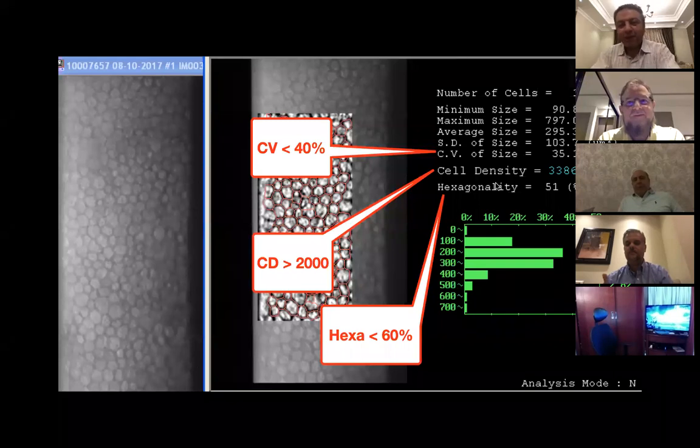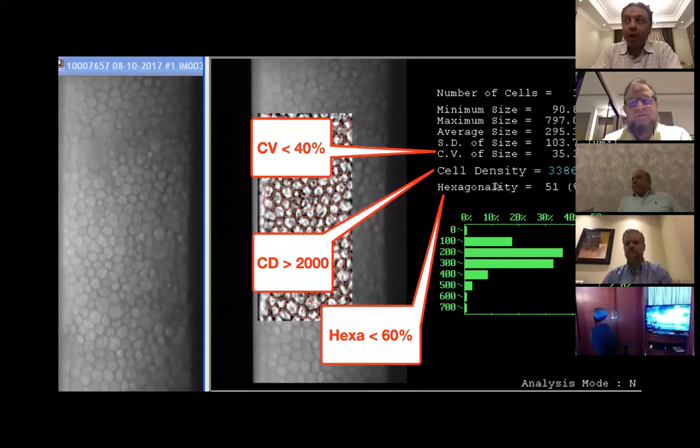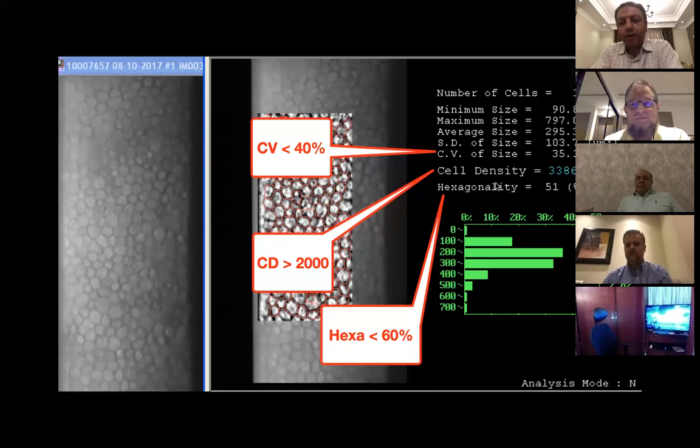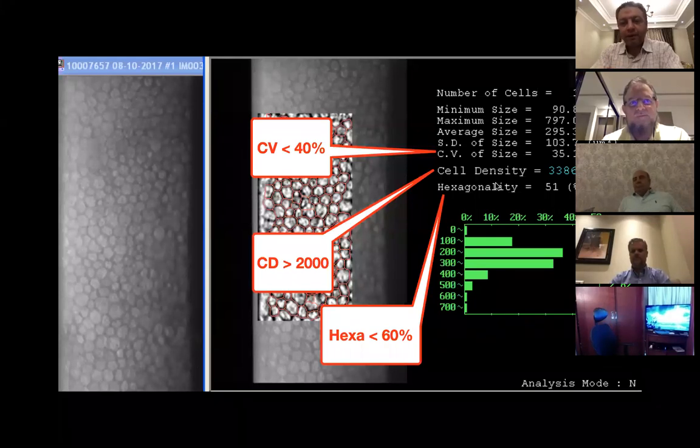Okay, sir. To complete the answer, I have extracted just one of my cases, in which I had used the iris claw. Nowadays, we are putting ICL, but in the old cases with iris claw, the anterior chamber depth was borderline, 2.9 millimeter in this case.